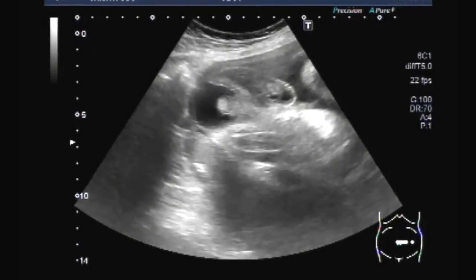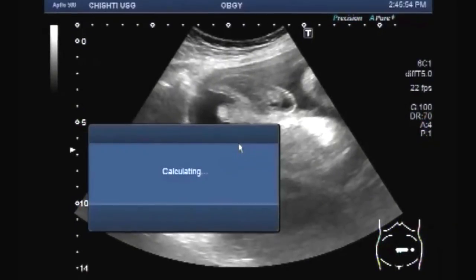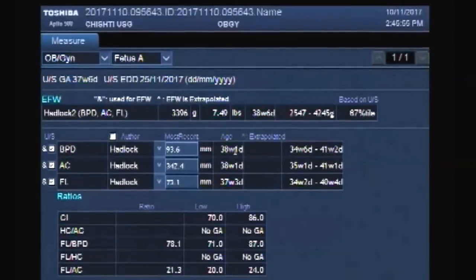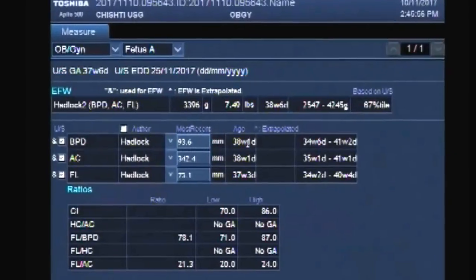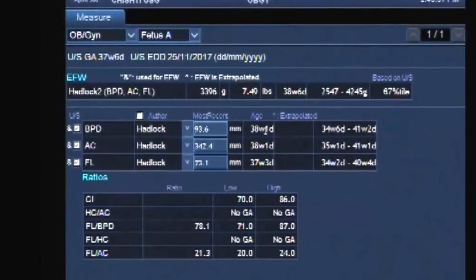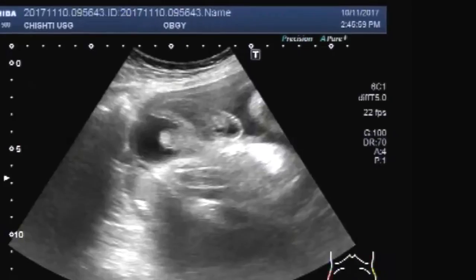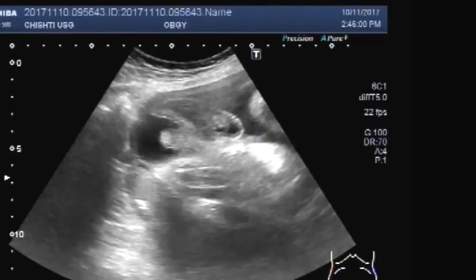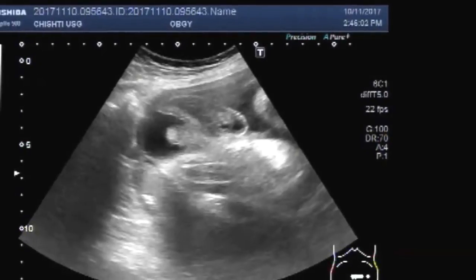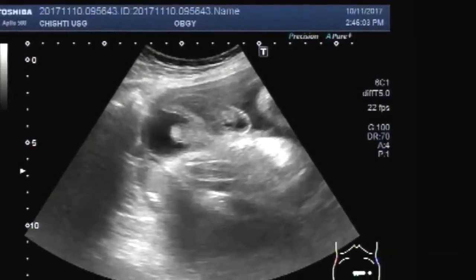Dear viewers, I hope you are all fine. Today you will see a fetus with unilateral undescended testis.